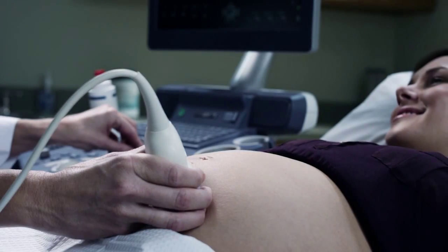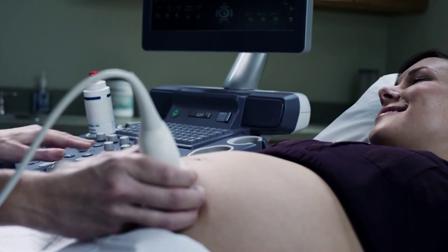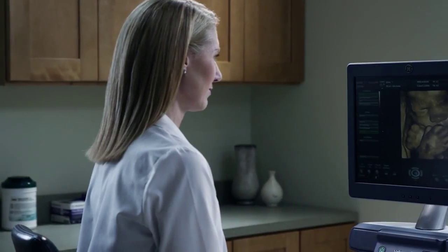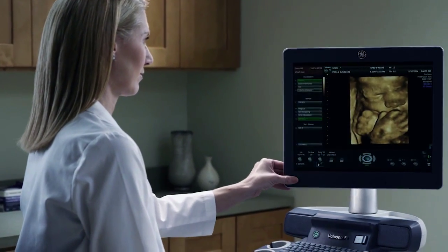Scientific evidence indicates that over a third of ultrasound probes in clinical use today have some form of failure which could put clinical diagnosis at risk.